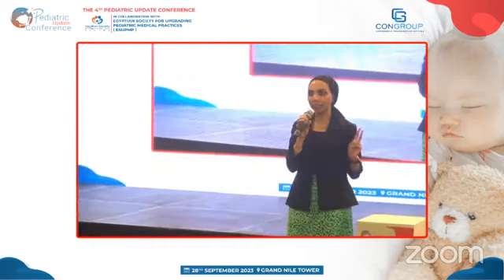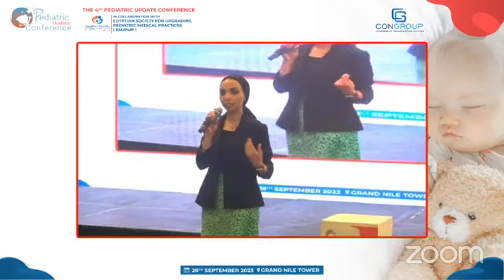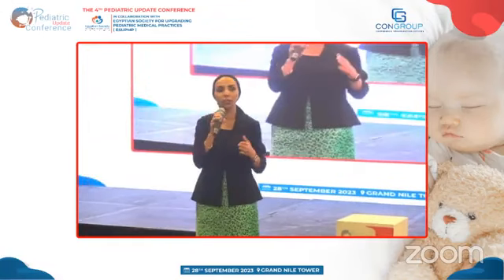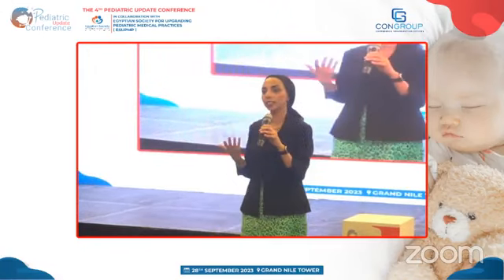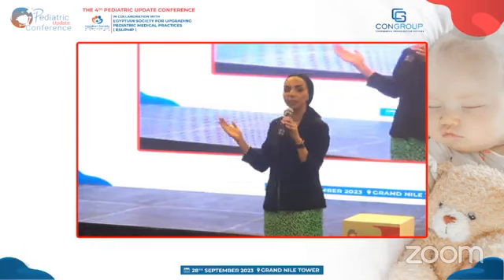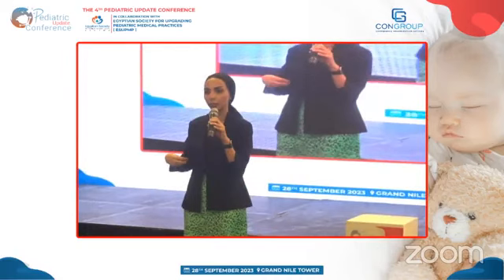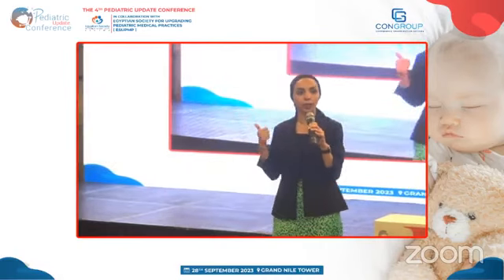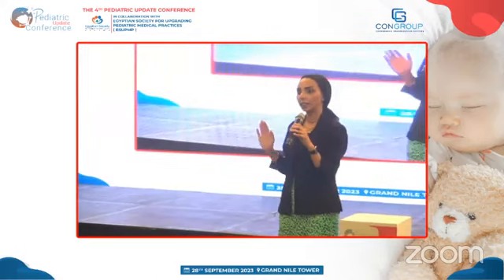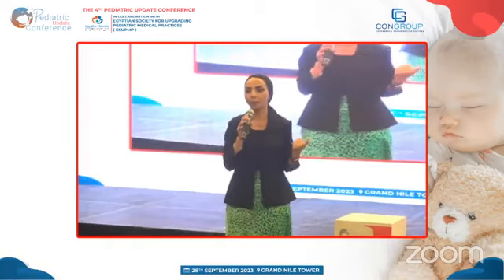ويلتزم معايا. حاجة تانية هتبقى راجعة للبيهيفير، ان انا هغير الكانيولا بتاعتي. دلوقتي احنا في كانيولا متركبة تتغير كل 3 ايام، فالسيستم هيبين لي برضو الكومبلاينس بتاعه اخباره ايه. ممكن الاقي ان الهايبر جلايسيميا دي اوت اوف ان هو محتاج بس يغير السيت، يغير الكانيولا بتاعته ويغير المكان اللي فيها. فانا هنا هطلع بيهيفير، ان ممكن انا اخد القرار العلاجي بتاعي بس ان انا بنصح العيان ده ان هو محتاج مور ايديوكيشن مش اكتر من كده، او ان انا هلاقي في حاجات في السيتنجز محتاجة تتغير.